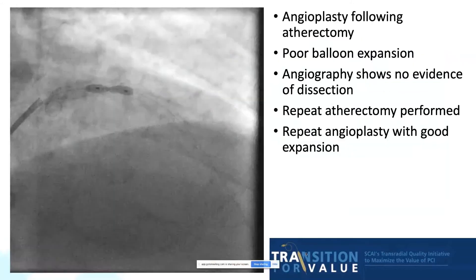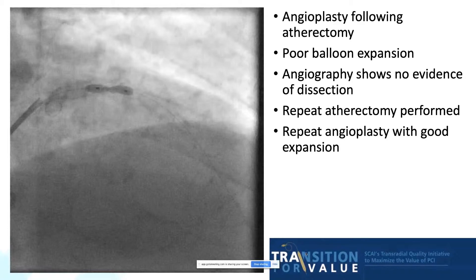Back to our patient. Angioplasty was performed following atherectomy; however, it showed poor balloon expansion. An angiogram was performed and showed no evidence of dissection, and thus repeat atherectomy was performed. Subsequently, the patient had repeat angioplasty with more optimal expansion.